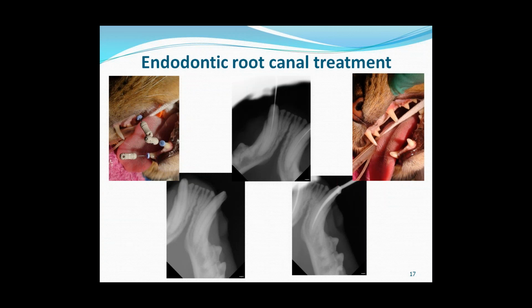Then moving across to the right-hand side, immediately downwards is a radiograph of the teeth to ensure there are no root fractures or damage to the surrounding bone, which there isn't. The radiograph in the middle shows an endodontic file in the tooth, and that's to ensure that the file travels all the way down to the apex, which is called the working length, because when you're doing a root canal procedure, you need to ensure that the entire pulp is removed. The teeth are then cleaned out or reamed out using the file, and then flushed, and then they're obturated with a gutta-percha material.